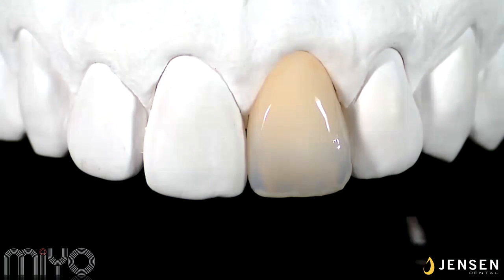After the halo effect is done, I will share a way to emphasize all the colors using stained linen and snow. Now fully taking advantage of contrast effects. Here I'm using stained linen to emphasize the contrast between the mamelons and the transparent corners. This starts to bring all the colors together on the incisal third region. Diffuse and mix the colors on one side and create a subtle blend. This will give a nice overall illusion of a layered ceramic restoration.